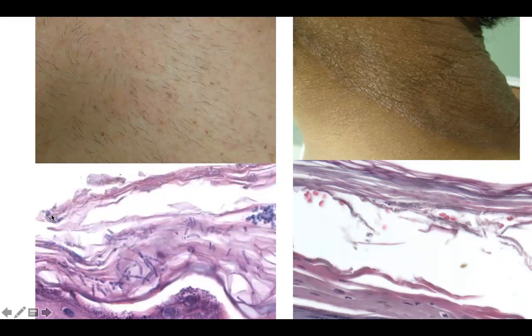But on the left, the stratum corneum is looser and more basket-weave. The organisms are more easily seen on the left — they are spaghetti and meatballs. On the right, the organisms are much harder to see and appear somewhat hollow, as circles in more elongated hyphal forms.